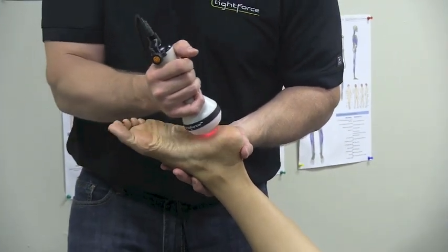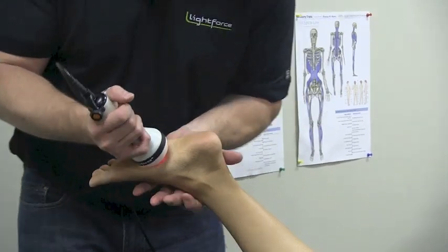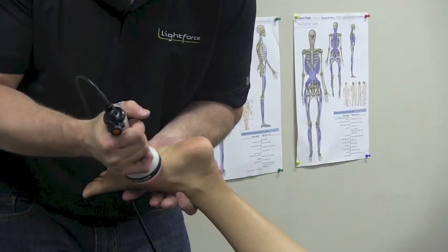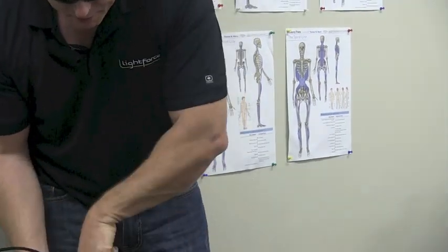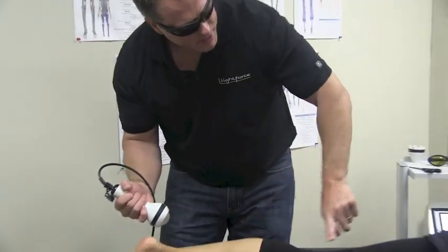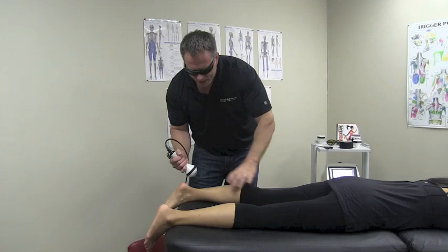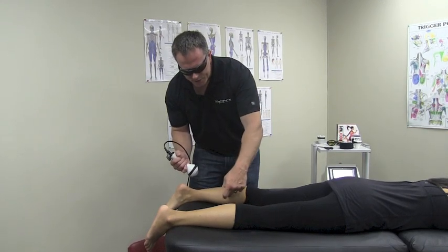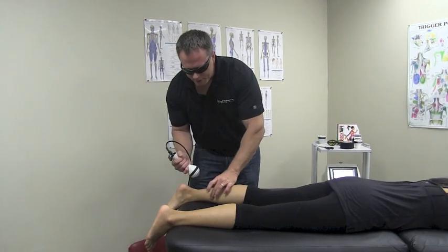I want to get some movement in that fascia, then they'll relax. I'll apply a good amount of pressure. Because the fascia on the bottom of the foot runs up the entire back of the body and actually ends above the orbit of your eye, I'm going to work and laser into the calf — the soleus, the gastroc, posterior tibialis, and all the flexor tendons of the foot.